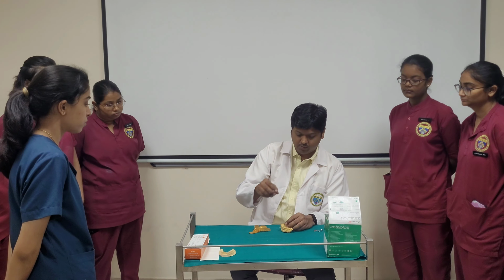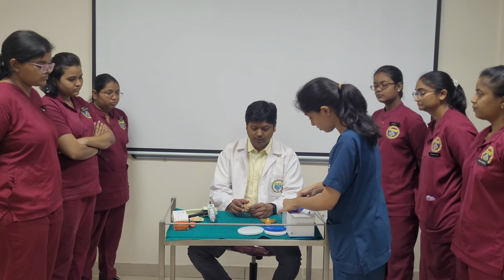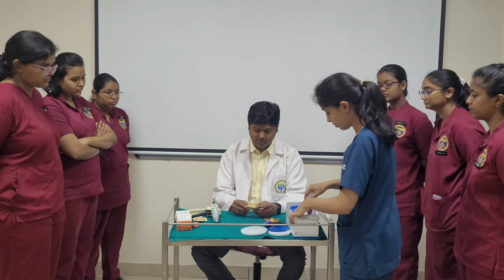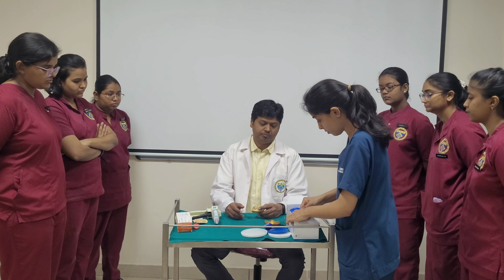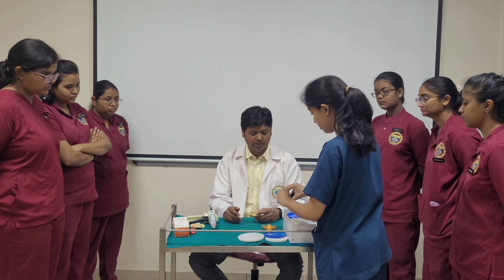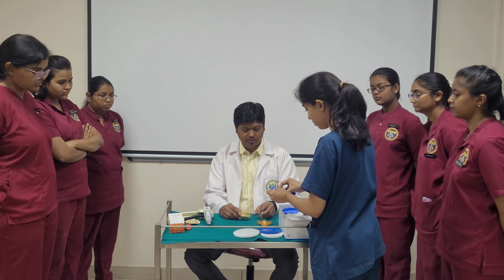Fix the transfer coping. So now I will be making the putty light body implant impression for closed tray transfer coping. So our putty material, equal amount, has to be taken, manipulated and loaded in the tray.